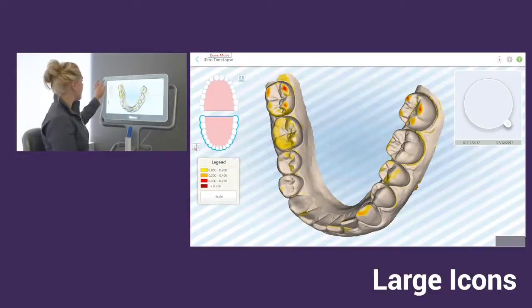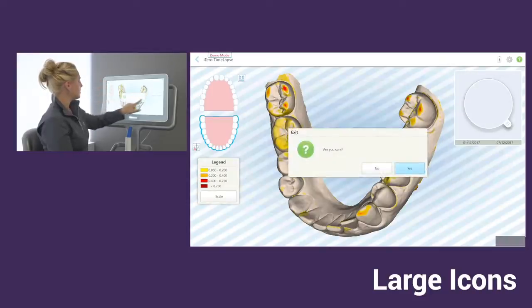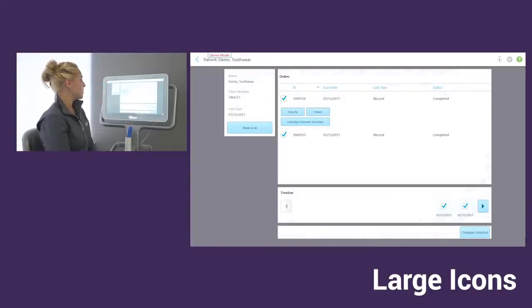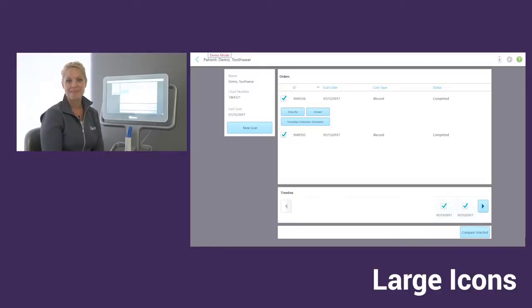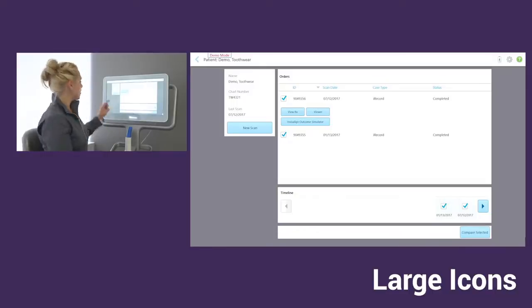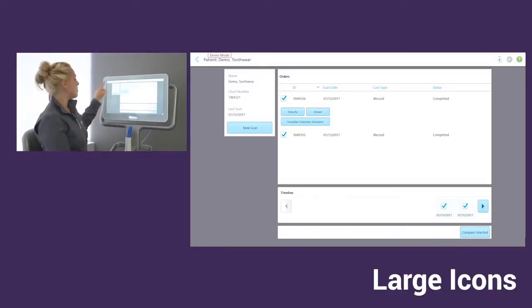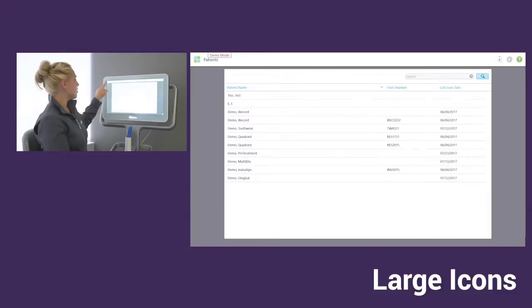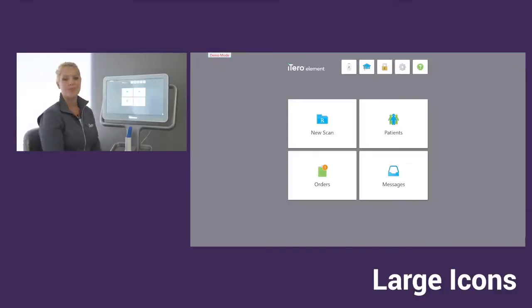Now to exit, I can tap on my top left corner and that will bring me back to the patient's icon. Now to go back to the home screen, I could tap on my blue arrow and then my home screen icon again and that will close me out.